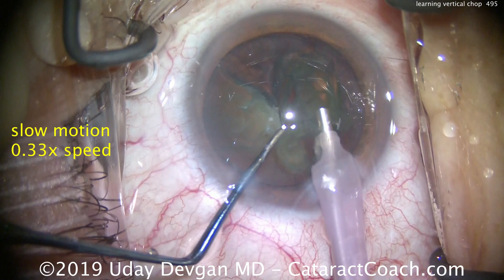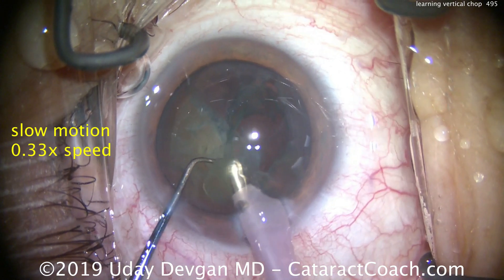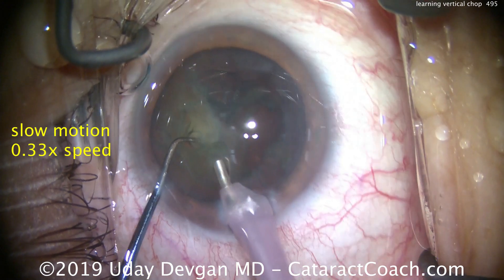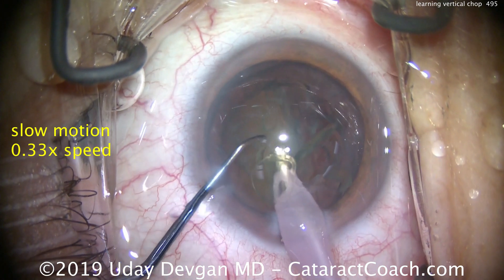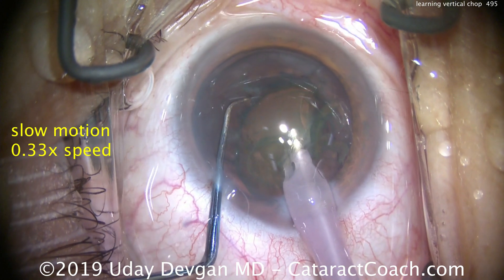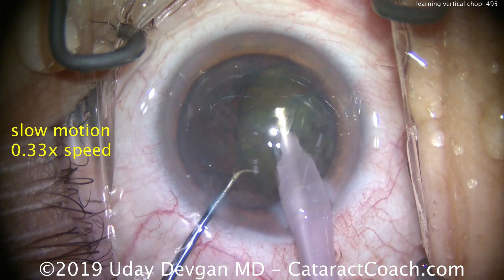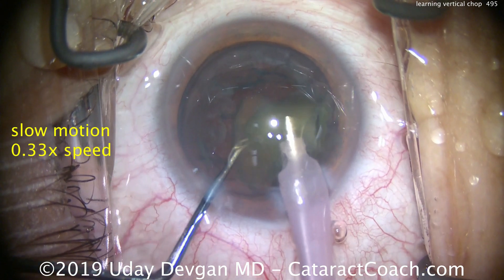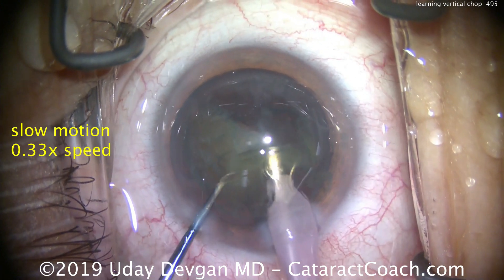The remainder of the first hemi-nucleus is brought to the iris plane and then just emulsified. Now there's just the one remaining hemi-nucleus in the capture bag. Buzz into the remaining hemi-nucleus, bring it forwards, and now place the chopper around the equator. Bring the two instruments together, then push them apart — that will separate the two pieces. Now we have a small quadrant that's been broken off and we can emulsify that.